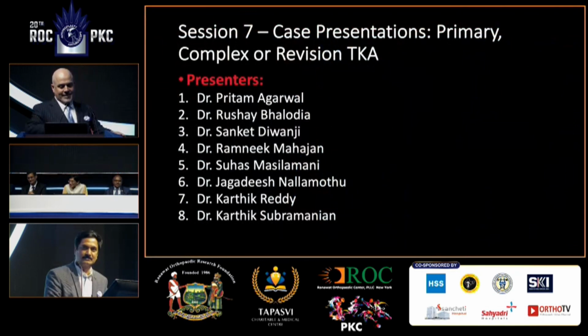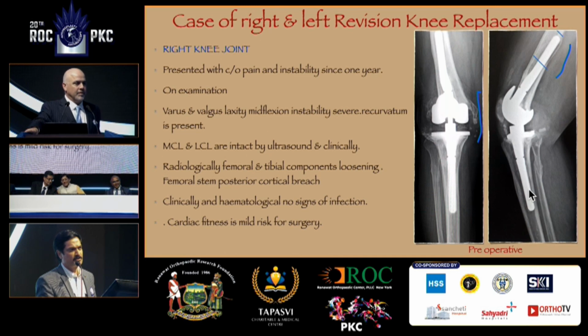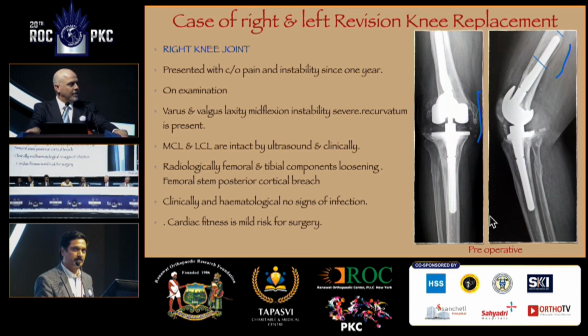Can I ask a question, please? What did you do exactly to the fracture of the tibia when you stabilized the tibia? How do you do that intraoperatively? Did you put a temporary plate as was discussed? No, I didn't put any plate. How did you manage to manipulate the entire knee without displacing? I stabilized with an intramedullary reamer. Probably somebody was holding the tibia from outside and stabilizing it from outside.